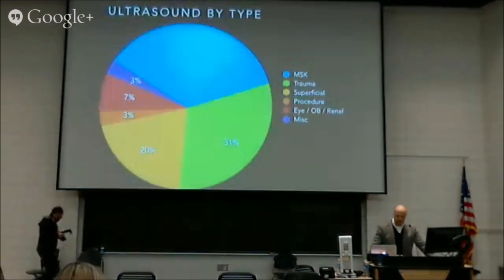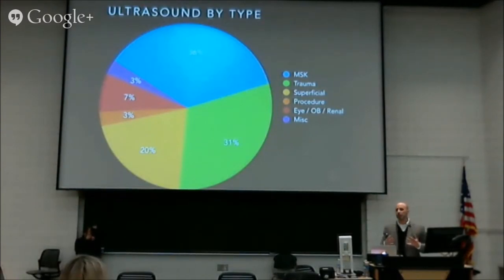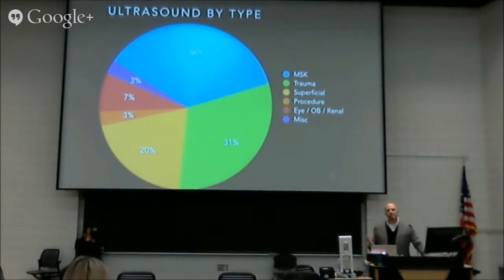Right? The other thing is that we have these conceptions about what would be useful. When I went to Iraq, I thought, you know, we're going to do a ton of FAST examinations. Nay. What we found when we talked to the special forces operators is that trauma only comprises about 31% of what we do. Because when you're 10,000 feet on a mountain, you know how you tell a fracture? Ultrasound. Increased intracranial pressure, right? High altitude cerebral edema? Ultrasound.